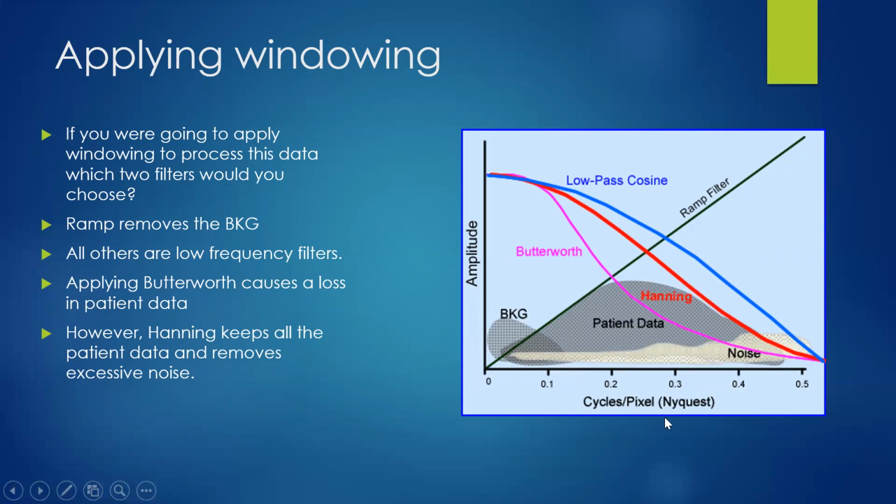So if I apply the 2 best filters, I want to maximize my ability to remove background, remove noise, and at the same time, maintain as much patient data as possible. Now, before I hit the next click on my mouse, note one thing. We're never able to really see this whenever we're processing. This is an artist's rendition of what we're doing theoretically to enhance image quality.